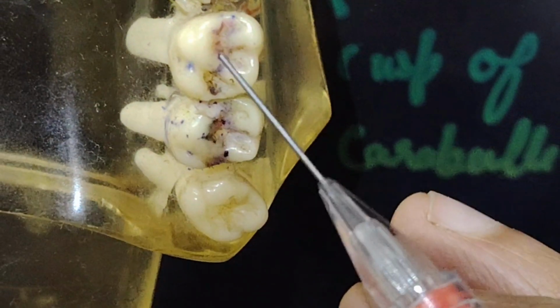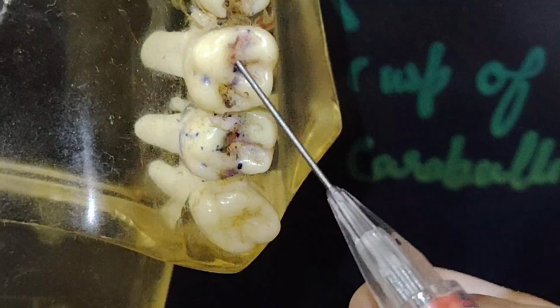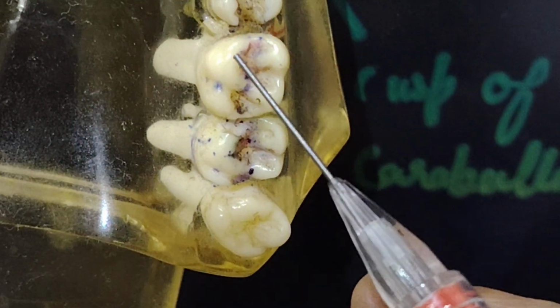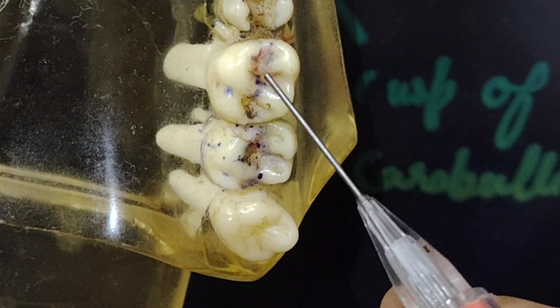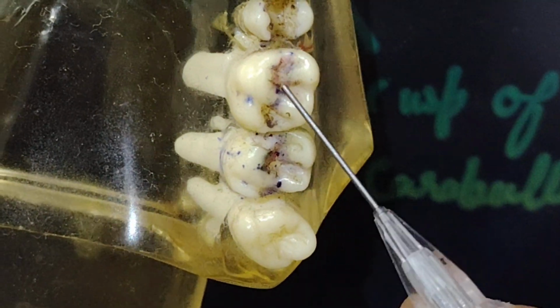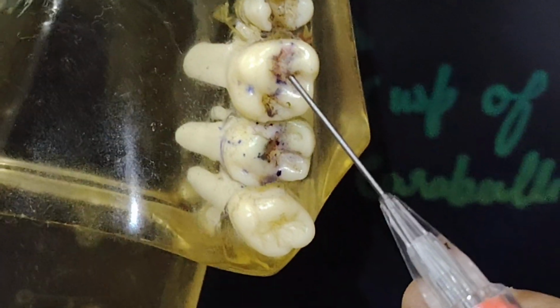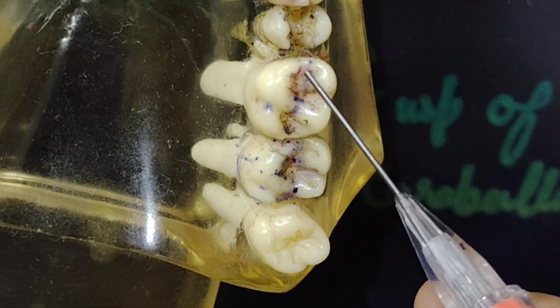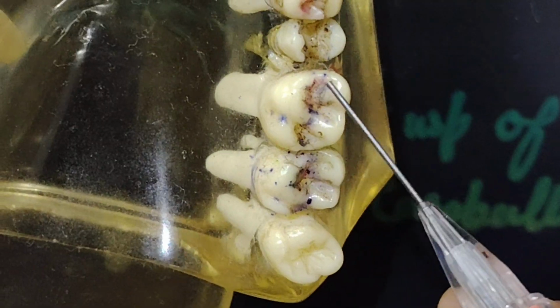Similarly, we again have this first molar. If this is a left side one, first we'll make a small ditch here, then we will go palatally, a little palatally. Then we will compromise this area, and here we go. This will be the location of your most probable distobuccal. This would be the location of mesiobuccal, and this would be the location of palatal. So we'll form the molar triangle.